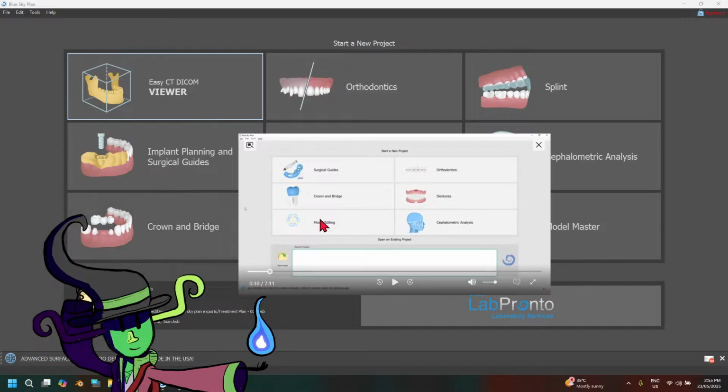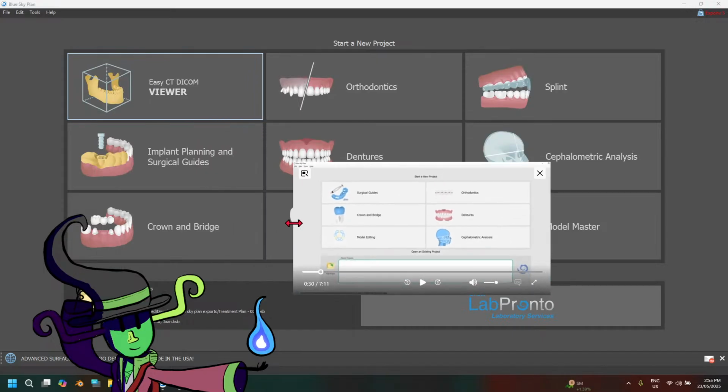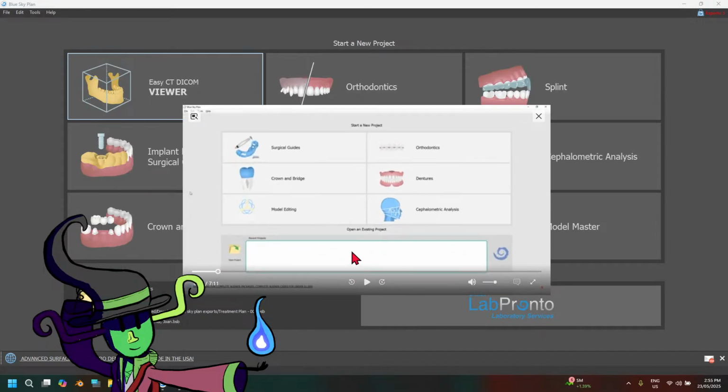Is that really your selling point, Blue Sky? The fact that you can export stuff for under $100,000. I can name a lot of things that are under $100,000.